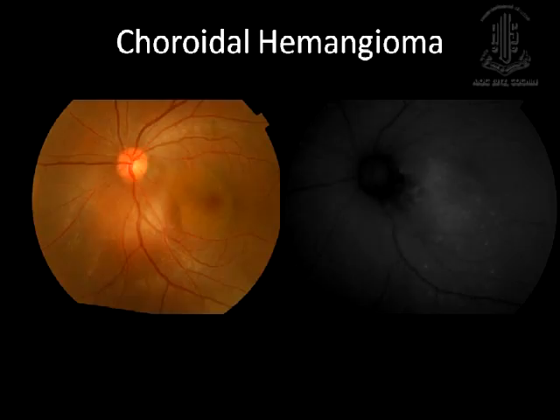There are other situations like choroidal hemangioma. This is accumulation of fluid. So this is the choroidal hemangioma, but in contrast you see the subretinal fluid is extending until here. So what we see is because of accumulation of fluid, there is lipofuscin accumulation. So this patient may have an impact on the vision because RPE is not healthy out here.